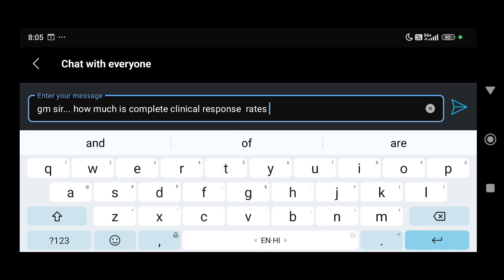But the thing is, what's the indication? If it's for FDG, definitely the blood sugar should be controlled. If it is for other reasons, we can go ahead and do the FAPI PET CT scan. What are the actual indications? Where do we do FAPI, sir?